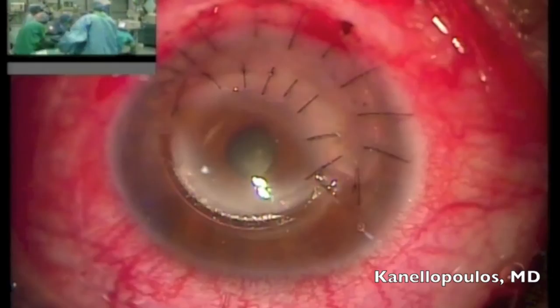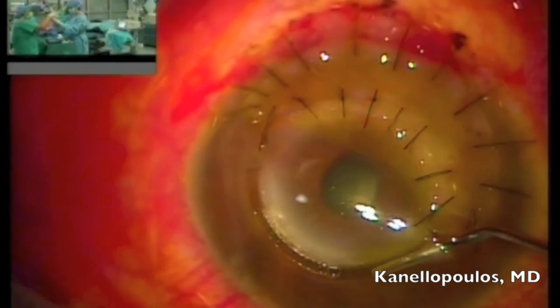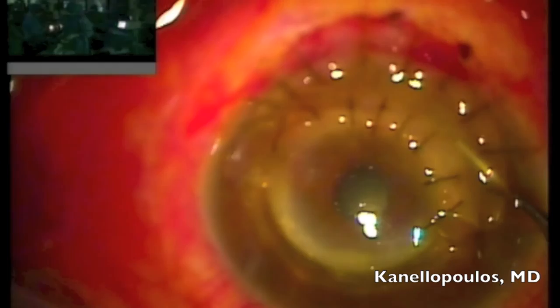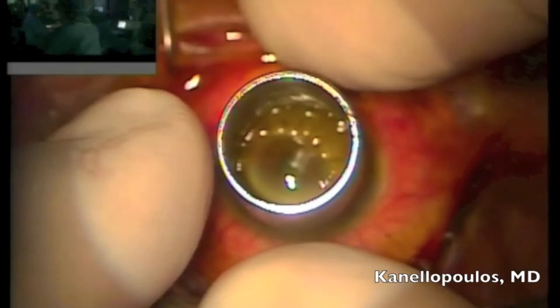Also, as you can see here, we're placing riboflavin solution — we're going to undergo a second session of cross-linking. We saw the preparation of the annular patch graft. I'm trying to place riboflavin in the channel; there's still air there obstructing riboflavin placement. On the other side, I'm able to fill the channel with riboflavin, and I'll place it under the patch graft and try and undergo another session of high-fluence cross-linking.